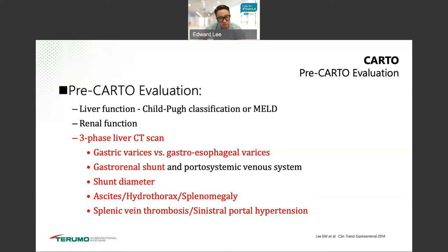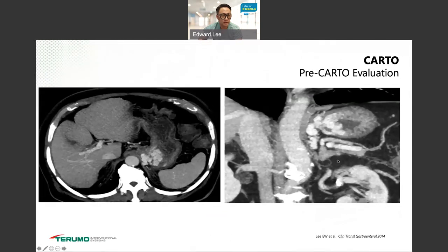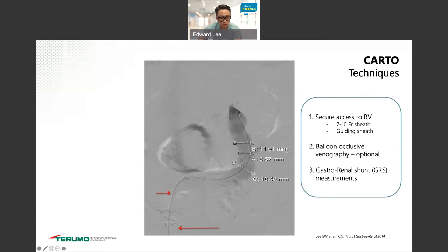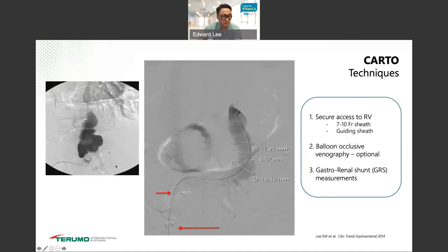If you have splenic vein thrombosis, this is a completely different disease — segmental portal hypertension rather than true portal hypertension — so the treatment approach is very different. Looking at the anatomy on CT: here are the gastric varices, and here's the shunt. You approach via the femoral vein, placing a sheath close to the IVC or into the renal vein, with one catheter through the sheath going all the way distally. A venogram is performed to measure the shunt diameter. A balloon occlusion venogram early in your experience is useful to understand the anatomy and fluid dynamics.